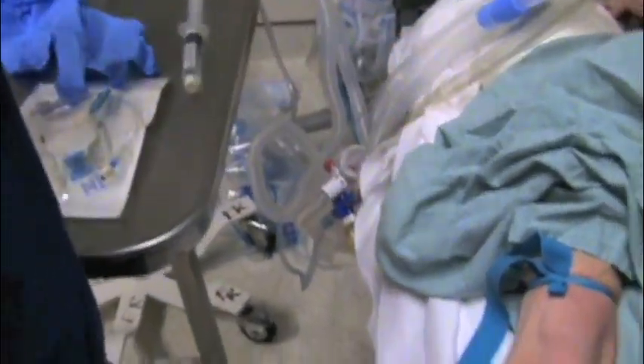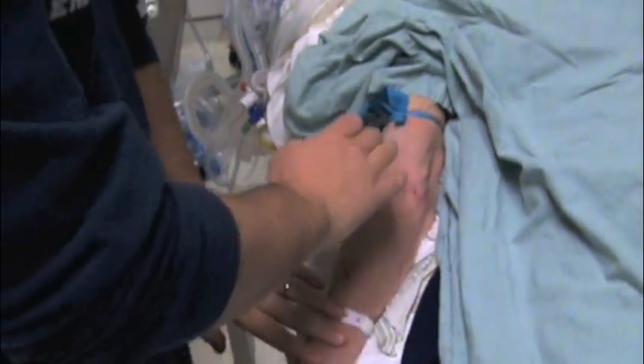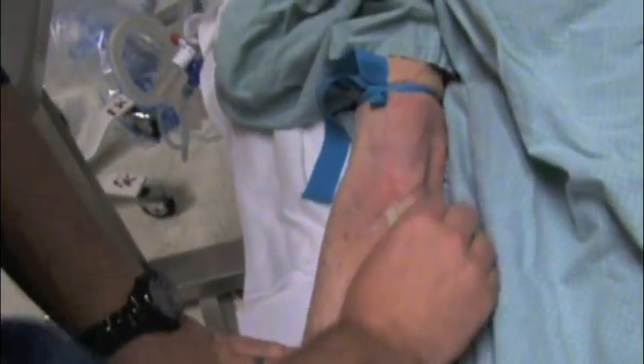There are a couple of veins back here that feel pretty good — they don't look nearly as impressive but they feel alright. I'd like to get an 18 in her just because of how sick she is. I tend to try and look for my vein with no gloves on so I can feel the vein better, and once I've found it, then I'll put my gloves on to actually put the IV in.